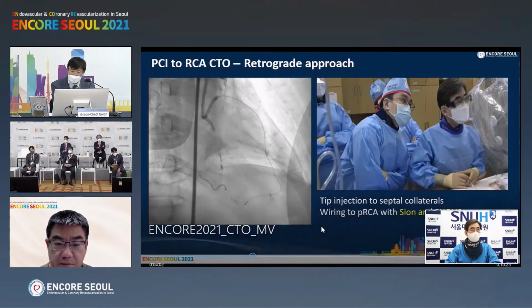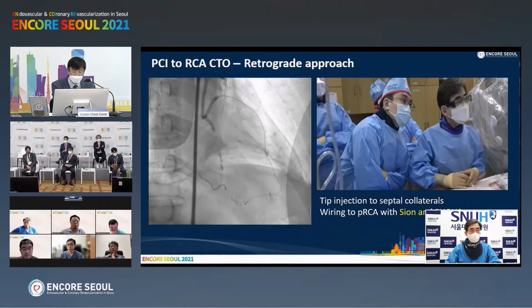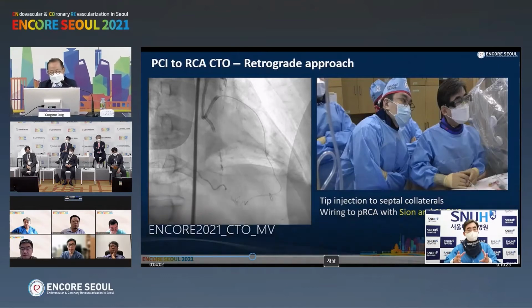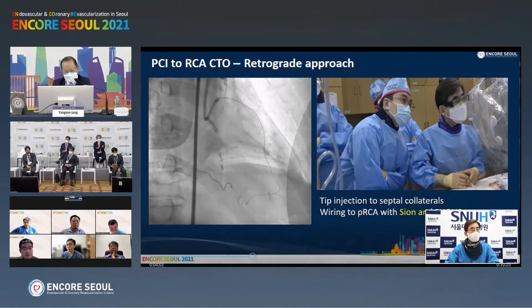The point where we check the tip injection is just in front of the second difficult point. So I'd like to once again clarify the morphology of the corkscrew, the most difficult point. Just before that segment, I did a tip injection, and remember that morphology. You are still on Sasuke, right? No, I changed from Sasuke to Caravel.